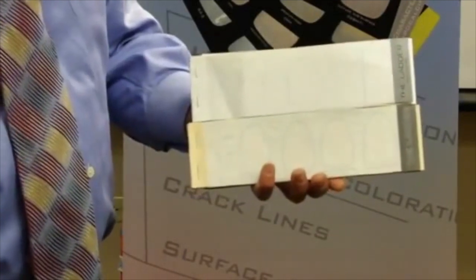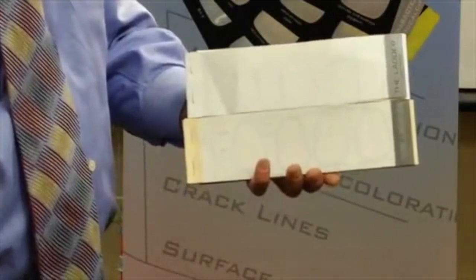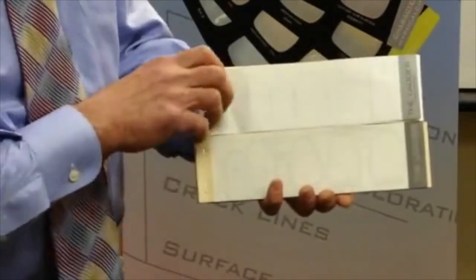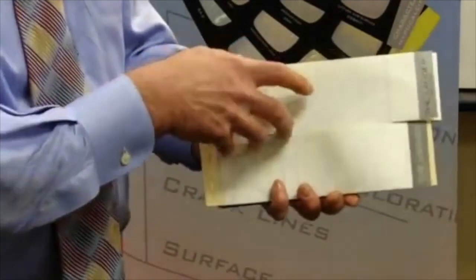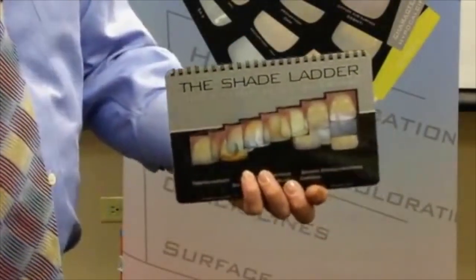If you're doing 8 units and they're all going to look the same, then you would prescribe it across the same. If you want to vary the appearance, then you can do this on the multiple unit prescription pad. And finally, the shade ladder, which is a supplemental reference.